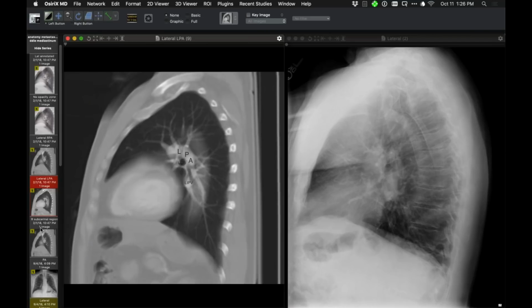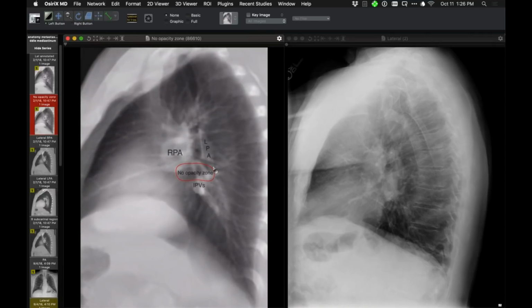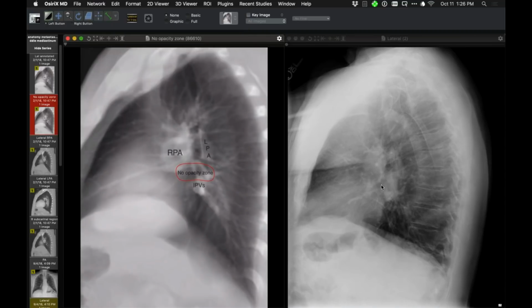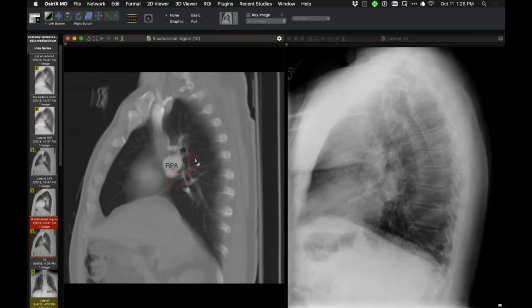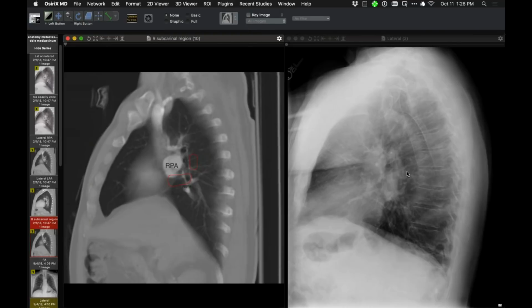And then I'll show one image here that I call the no opacity zone. And this is one no opacity zone that's located here, which in this person is definitely abnormal. And then more subtle in this patient is the other no opacity zone, or at least in this area here behind the bronchus intermedius, there should only be opacity that can be accounted for by a normal left pulmonary artery. And if you think you see something abnormal here, and of course it can be subtle, and you don't see posterior wall of bronchus intermedius too, it adds up to pathology. So this here and that there.